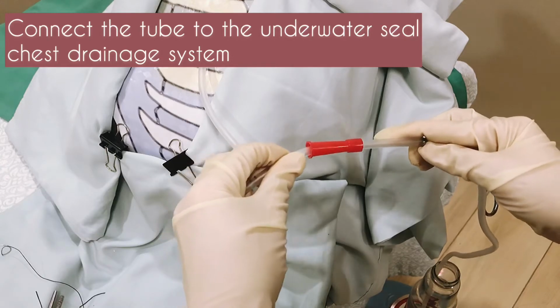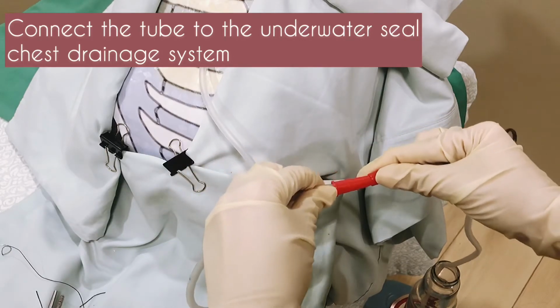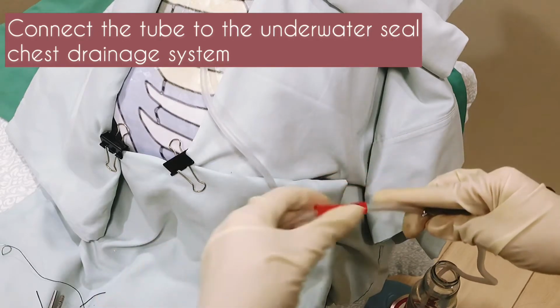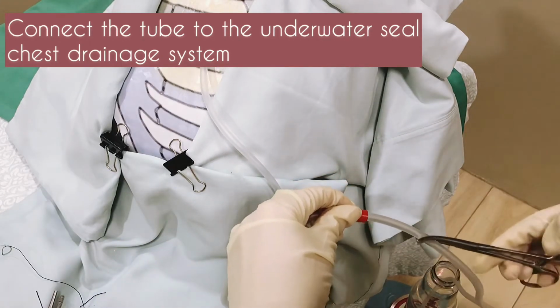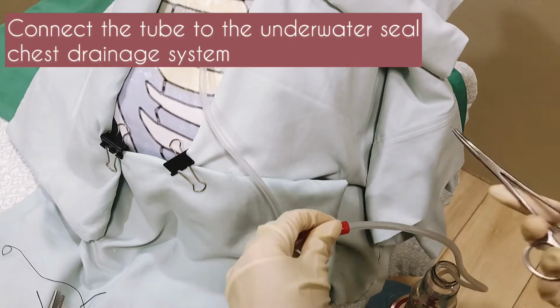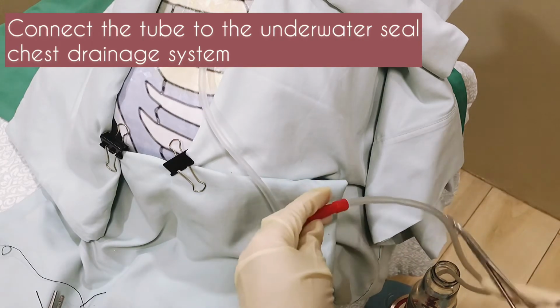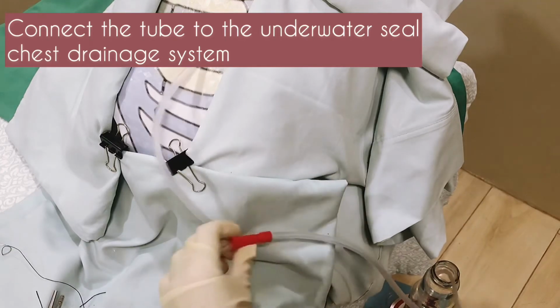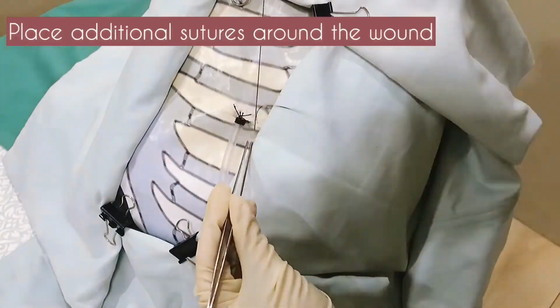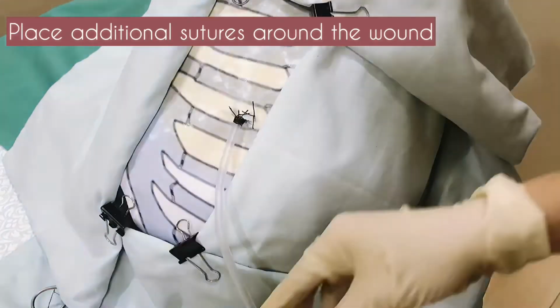Connect the tube to the underwater seal chest drainage system. Care should be taken to do this step properly as this may cause pneumothorax if the tube is disconnected from the underwater seal. You may place additional stitches around the wound.